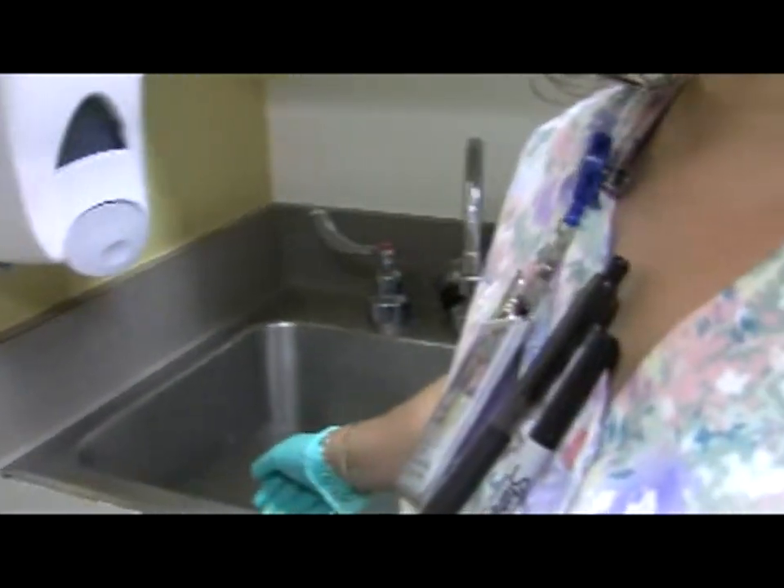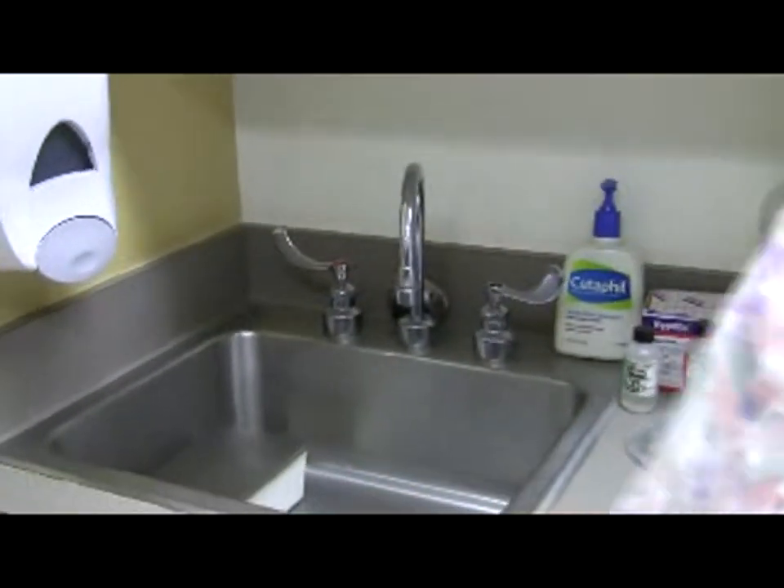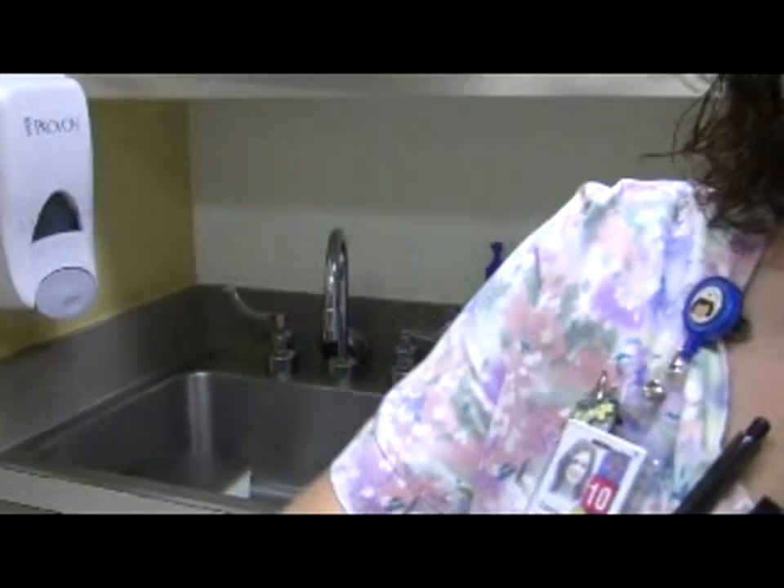Collect the instruments from the bin. Do not put your hands in the bin. Instead, use gloves. Pick up the basket containing the instruments by the handle on the side.